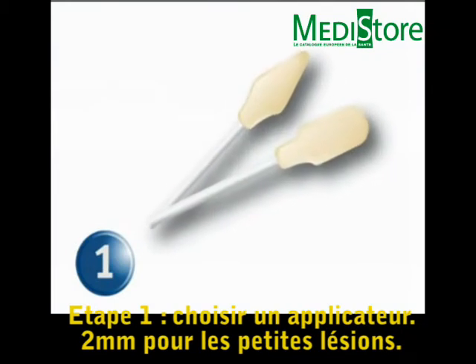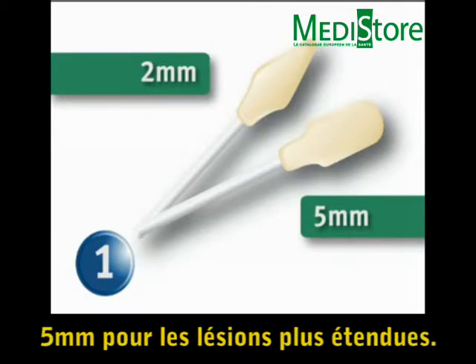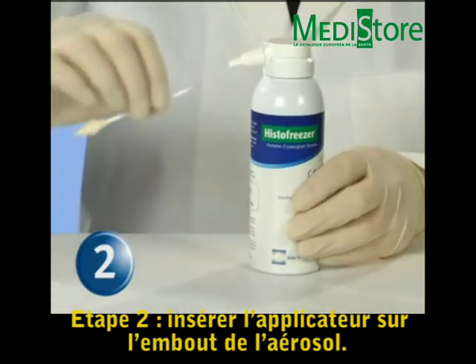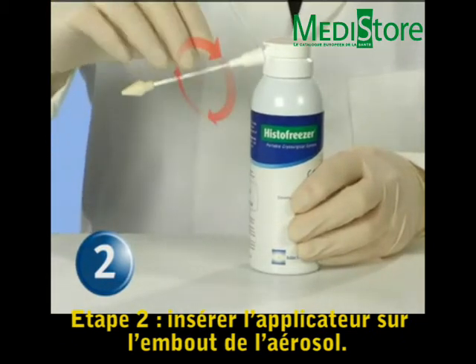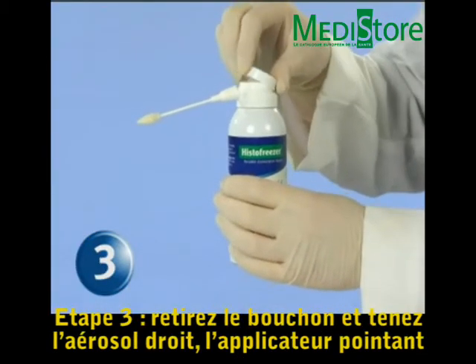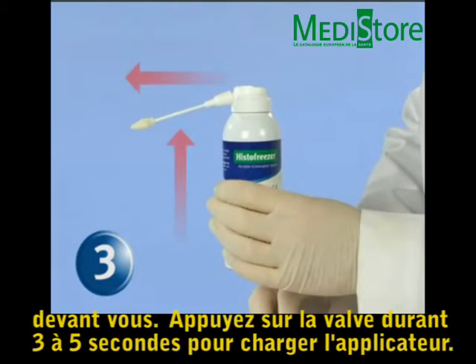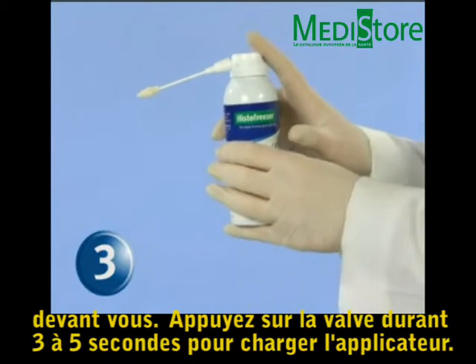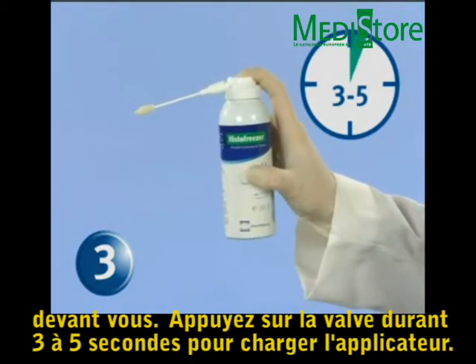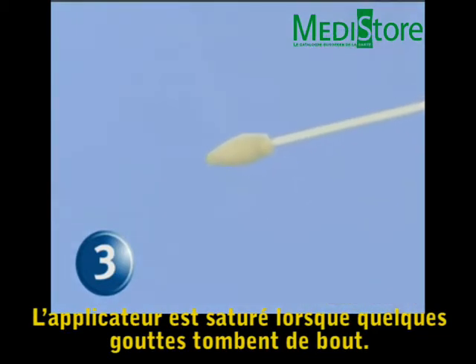Step 1: Choose a HistoFreezer applicator. Use the 2 mm for smaller lesions or the 5 mm for larger lesions. Step 2: Insert the HistoFreezer applicator into the HistoFreezer canister. Step 3: Remove the protective cap and hold the canister upright, with the applicator pointing away from the body. Press the dispensing valve for 3 to 5 seconds to charge the applicator. Saturation of the applicator is complete after several droplets fall from the tip.